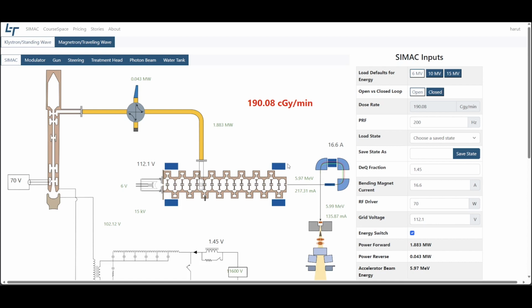Because of the scatter contribution to the beam dose, the dose measured in a radiotherapy beam will depend on the field size. The larger the field, the higher the dose at the center for the same monitor unit settings. It is usual to calibrate the linear accelerator at a standard beam condition such as a 10 cm by 10 cm field at a depth equal to D max, and then measure the dose difference at different field sizes.